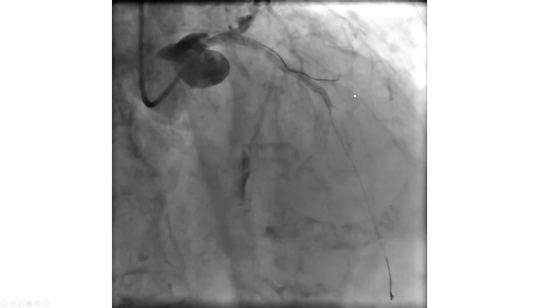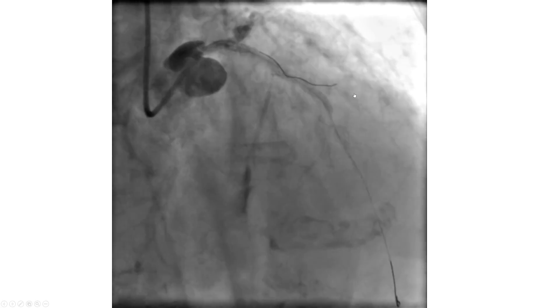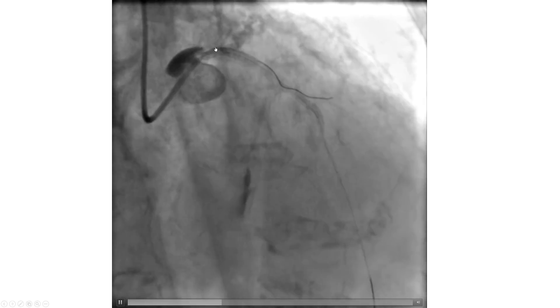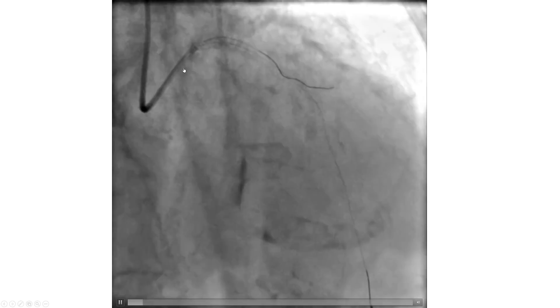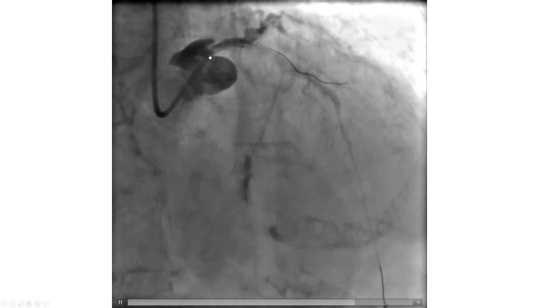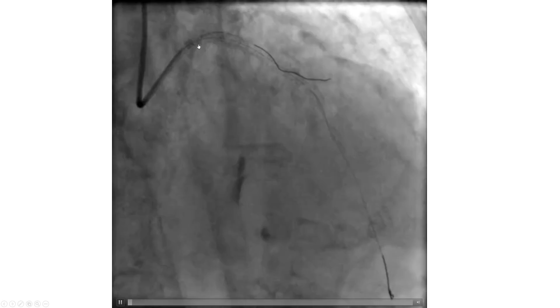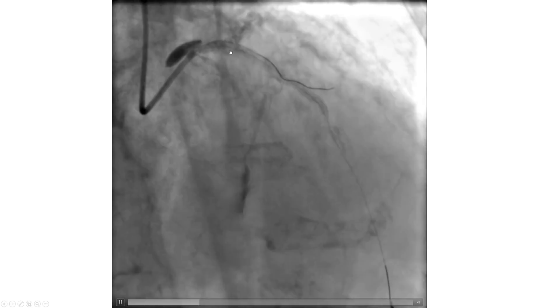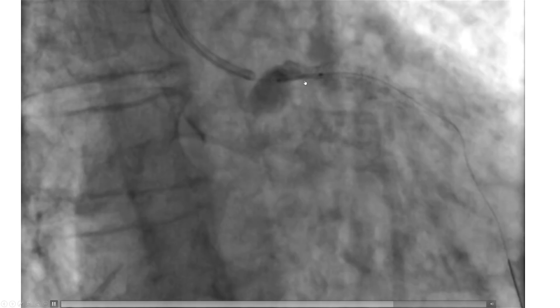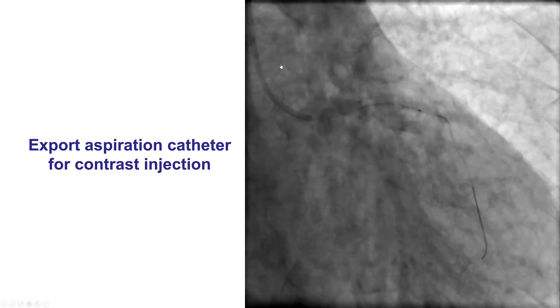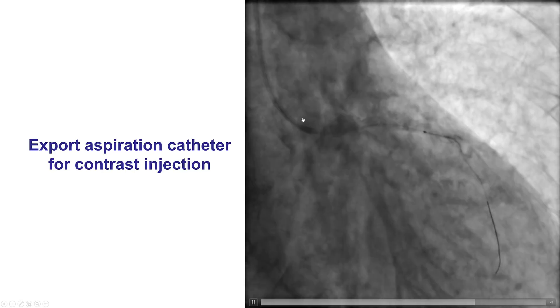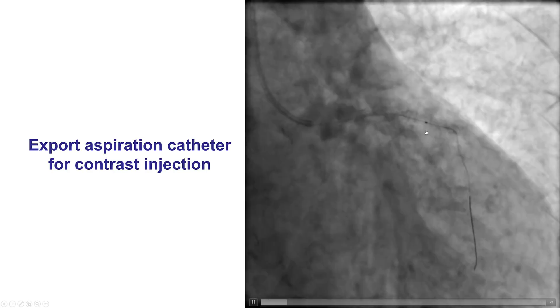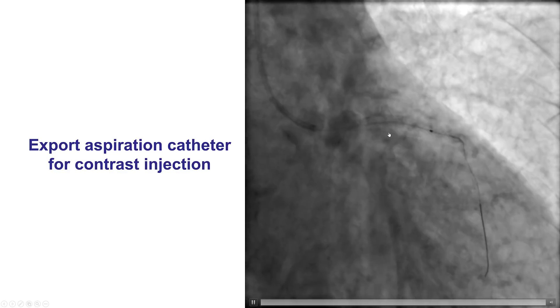The stent was placed, but immediately afterwards on repeat injection there was now a major aortocoronary dissection. Interestingly, the stent we had placed was not protruding all the way back to the aorta, leaving a small gap, and that is where the major aortocoronary dissection occurred. The key for those dissections is to not keep injecting but to quickly cover it with a stent — which is exactly what we did. We placed a short stent covering from the previous stent all the way back to the aorta. We then used an export aspiration catheter into the mid LAD and injected through that to minimize the risk of extending the dissection.